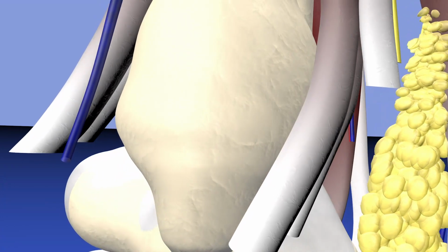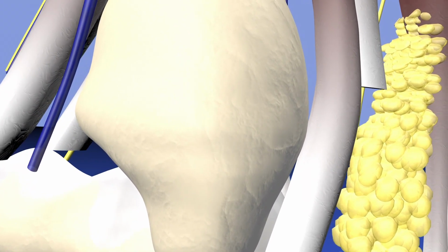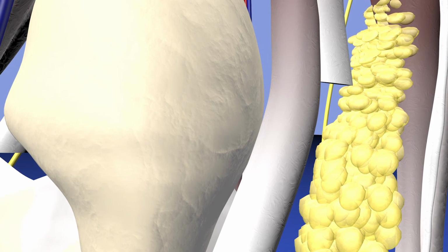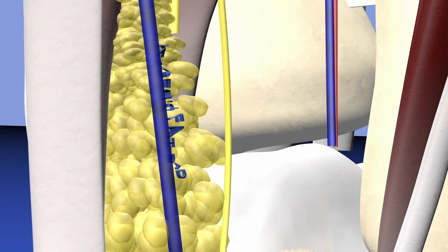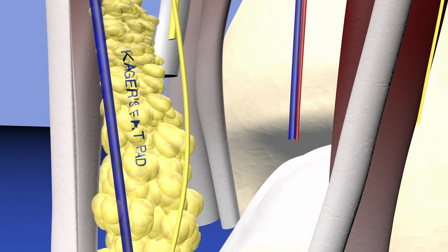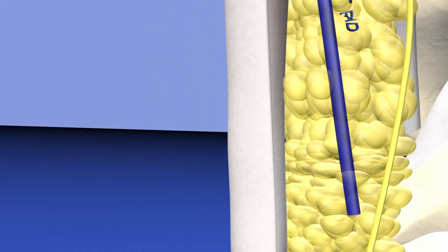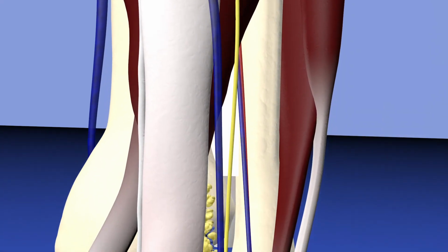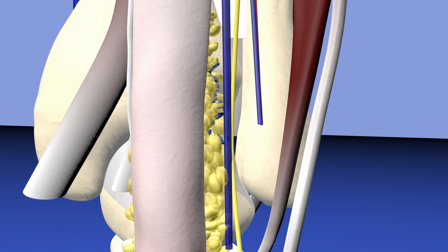We're rotating medially now, and we can see the tendons on the medial ankle, tibialis posterior, flexor digitorum longus, and the flexor hallucis longus tendon as well. And now we're rotating again laterally. And again, you can see Kager's fat pad labeled here. I can also see the lateral aspect of the Achilles tendon. And here's a gross depiction of this lady's Achilles tendon. You can see how it's thickened and erythematous at its distal aspect.